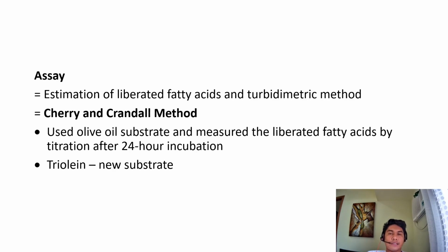Next, regarding assay, usually it is based on the estimation of liberated fatty acids and the turbidimetric method. The first method for the measurement of lipase is the Cherry-Crandall method.